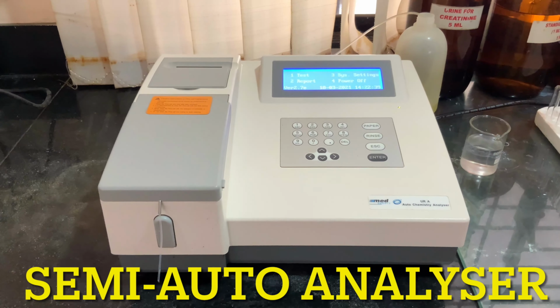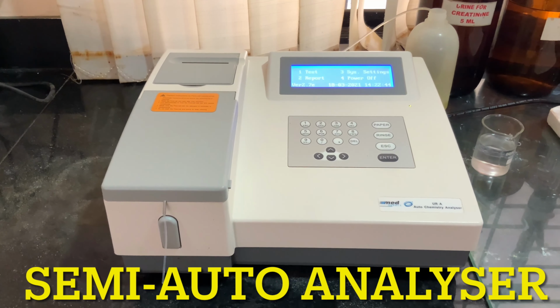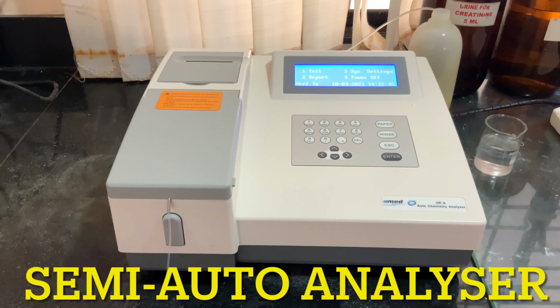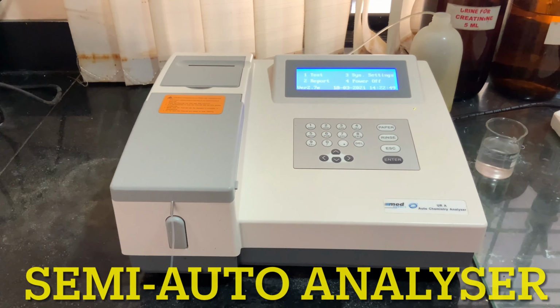The semi-auto analyzer calculates the result or the concentration of the solution automatically by the formula that is pre-fed into the machine from the absorbance value that is measured by the machine.